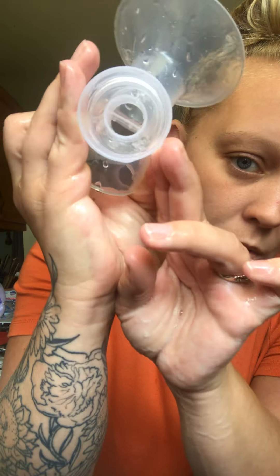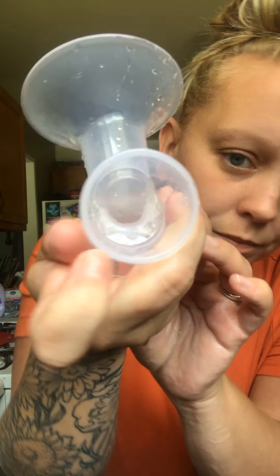And then we rinse it. Now there's very minimal milk buildup in there. You're not going to get them brand new, but do your best to get as much as you can.